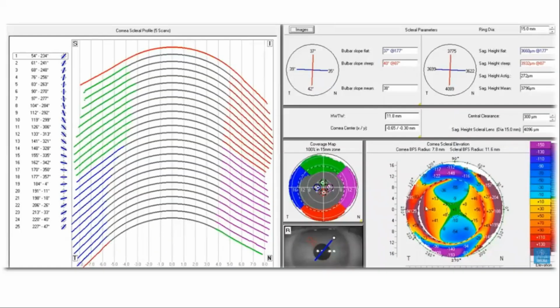Dr. Tulsi, do you require AXL for this, or even on the normal Pentacam, if you have the software for contact lens fitting, maybe we can do it? I don't think we need AXL because there's no purpose of measuring axial length for contact lens fitting. This should require only the corneal fitting basically, and that is entirely possible on all Pentacams. So maybe we should look on our Pentacam whether we have the contact lens software. Maybe we don't. This is an optional software, I think, which we didn't take because we didn't know whether it will be of much use to us.